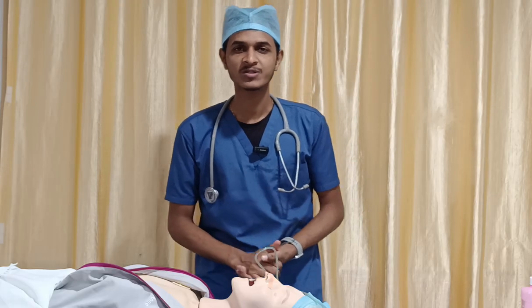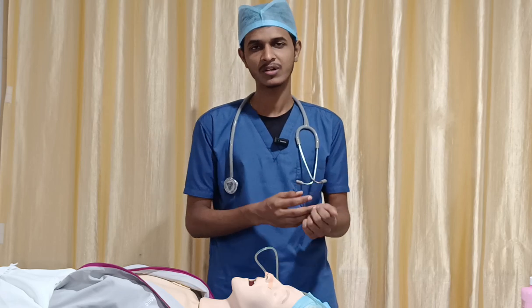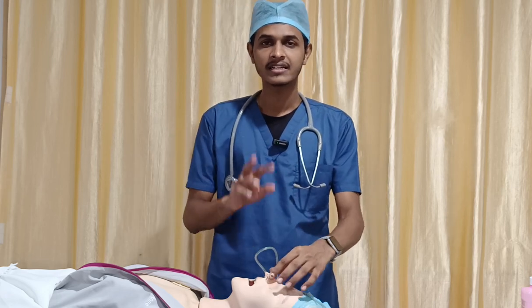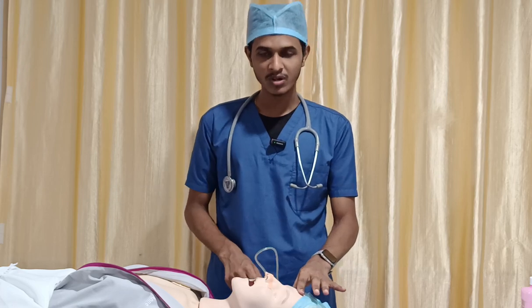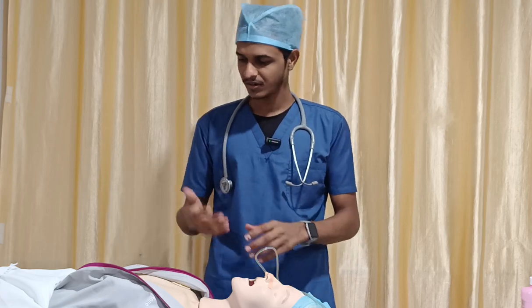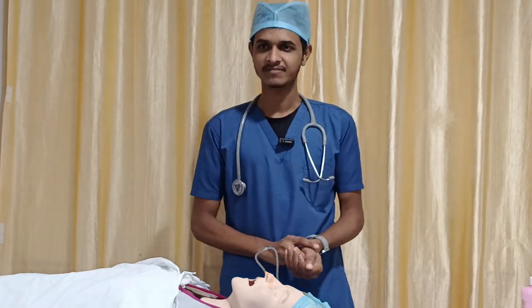Finally, the post-procedural part. Here we have to remove our personal protective equipment and discard it with correct waste segregation, and then you have to anchor the catheter in two regions. First one, over the nasal cavity. Another one over your forehead. So these are the two areas where you have to anchor the catheter, and then finally you have to recover the person, document it properly and thank the patient.